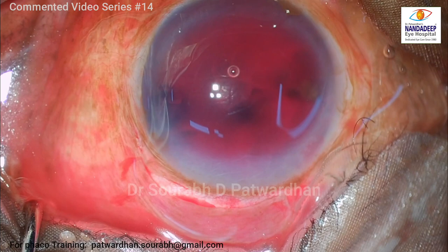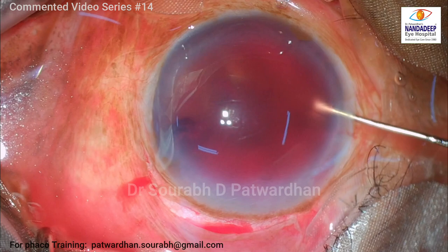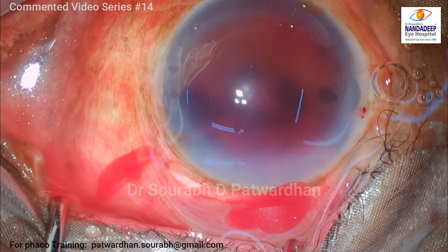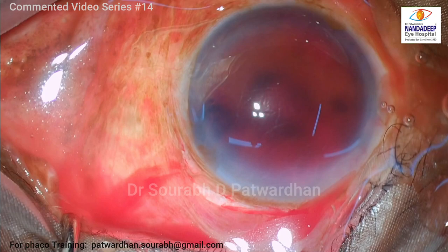You can see that I have made one side port incision and injected a little bit of OVD there just to check whether it's a clot or there is some liquefied blood. As you can see, some part of the clot is liquefied. Whenever a clot forms over a period of seven days, the liquefaction also starts, and maximum liquefaction occurs between seven to ten days. But if you keep this kind of clot in the anterior chamber, it will give rise to long-term complications, so it's best to remove it.